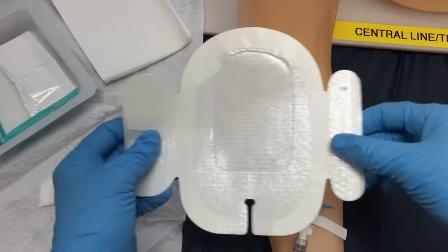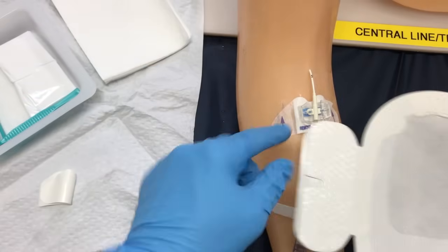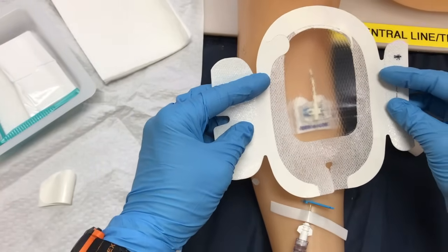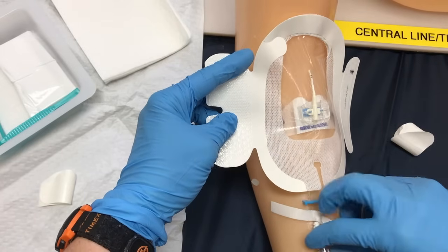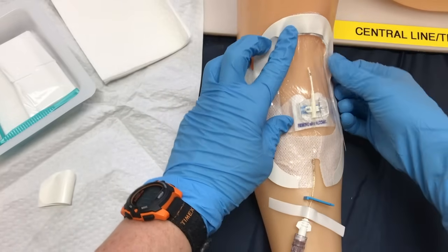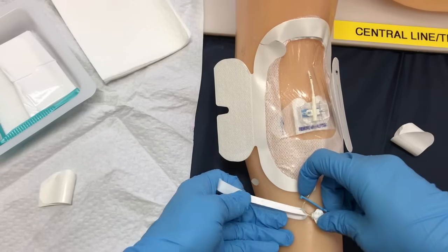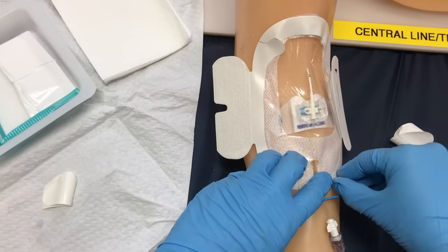I'm going to take my Tegaderm — we want the insertion site to have a nice window of Tegaderm around it. We're going to put this loosely over top so it's about in the center. I'm just going to move my line over a bit. Then smooth down our edges. I can take off this holding tape now and remove the film of my Tegaderm.